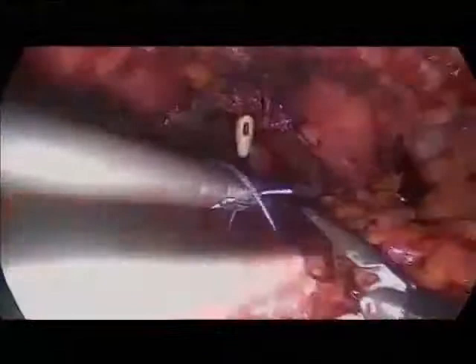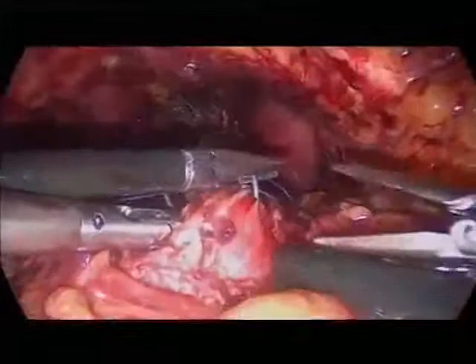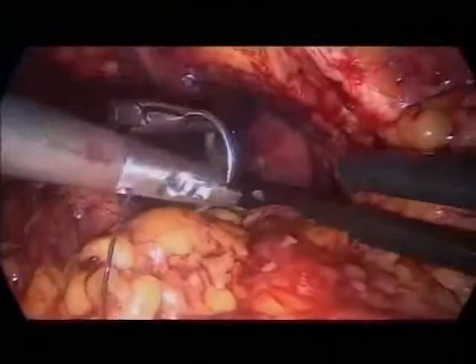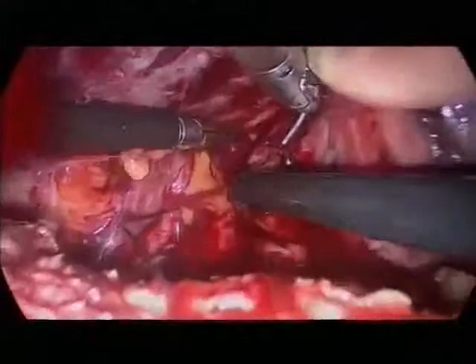Get directly on the prostatic fascia here. You see the pelvic fascia. You see the prostatic fascia. Yeah, exactly. So this will be your layer. Ah, this is nice. Now you see, this is what we saw before. It's not very easy in this patient. We have two layers. You see, the pelvic fascia is here. You have the pelvic fascia, and I try to remove the prostatic fascia from the prostate.